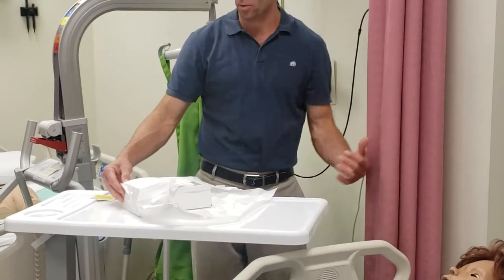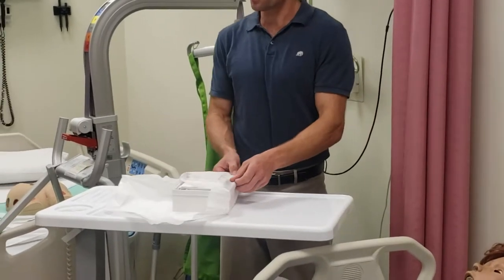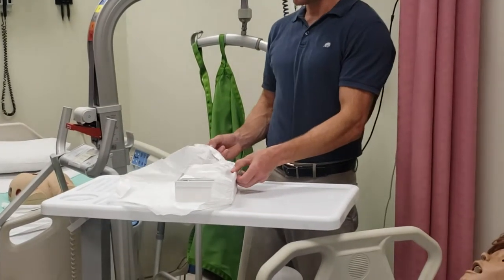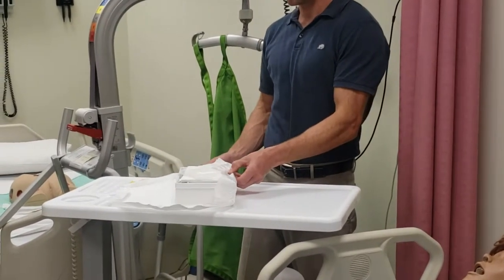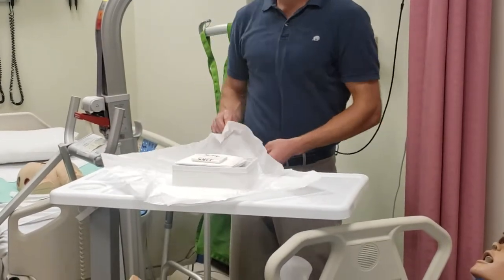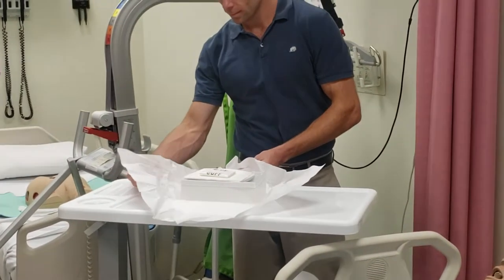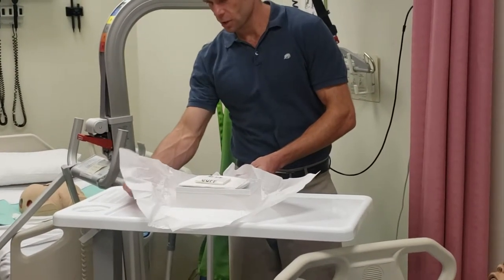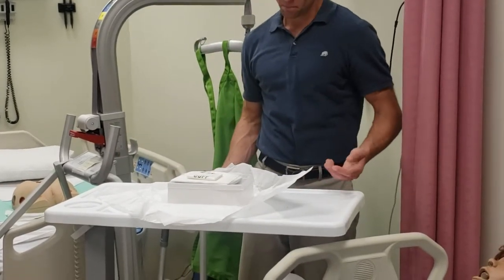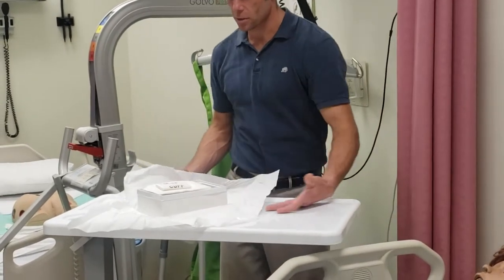You see when I move my arm, I move it around the sterile field instead of on top of it. These little things probably don't make a difference in real life most of the time, but if they make a difference 1% of 1% of the time, then that's someone. I don't like that because my drapes are borderline hanging over the edge, so I'm going to square it up.